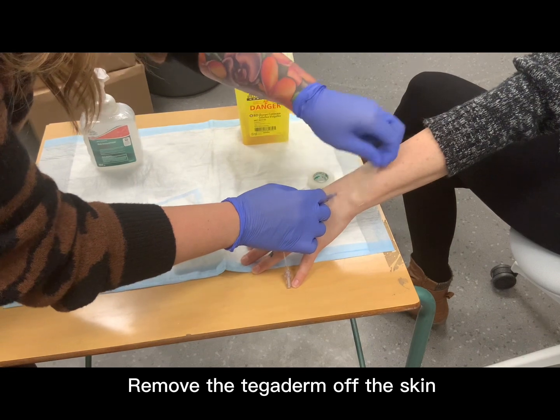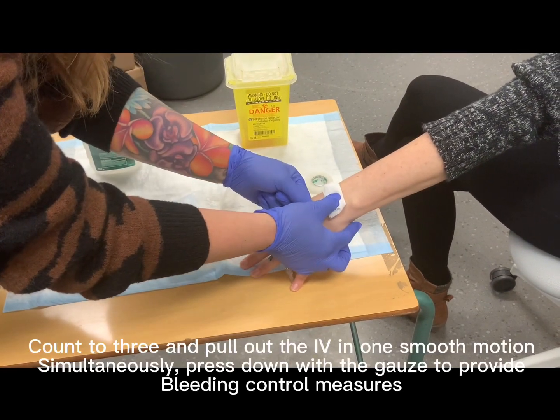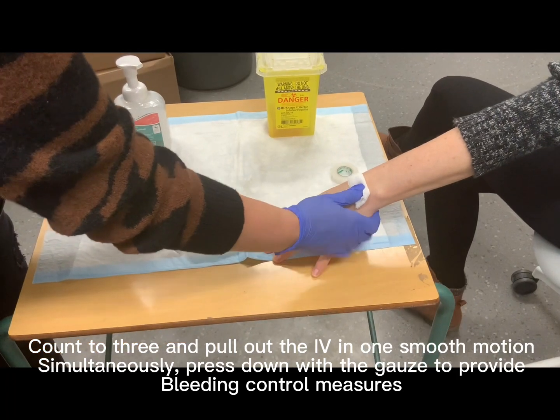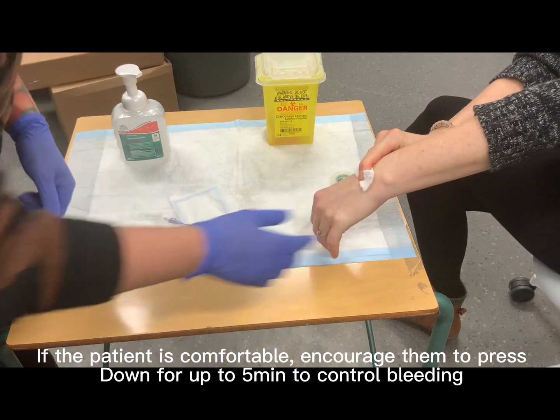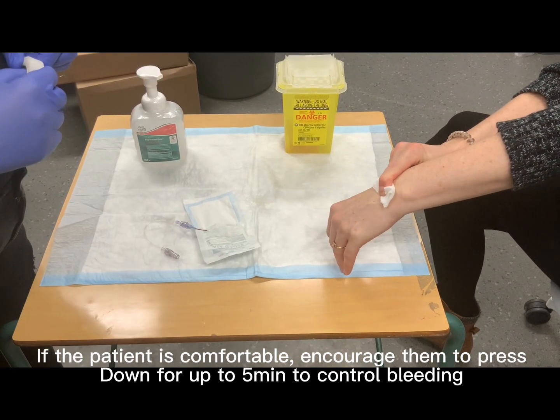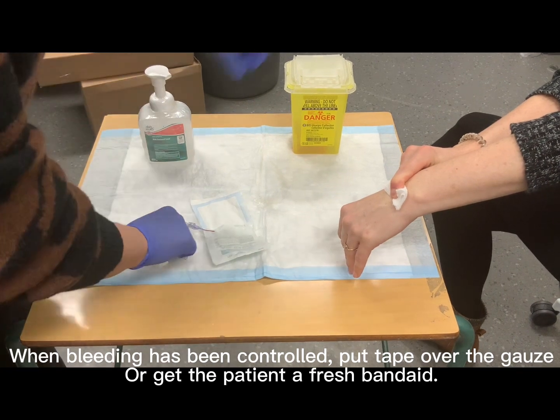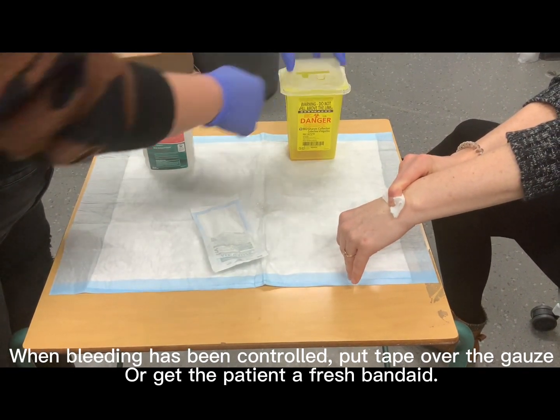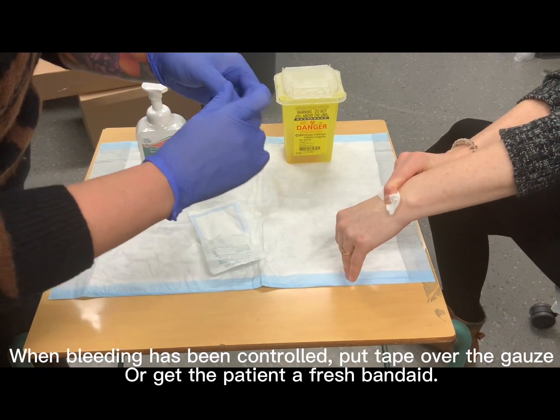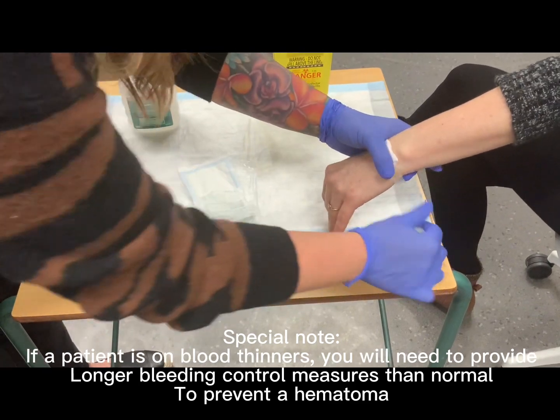While holding the IV down with one hand, remove the tegaderm. Place the gauze over the site of initiation and in one smooth motion, remove the IV. Hold pressure over the wound for up to 5 minutes, or if your patient is compliant, you can have them do this themselves. Place the used IV in a biohazard container. Place tape over top of the gauze, or if you have a Band-Aid and the patient would prefer, please use that.